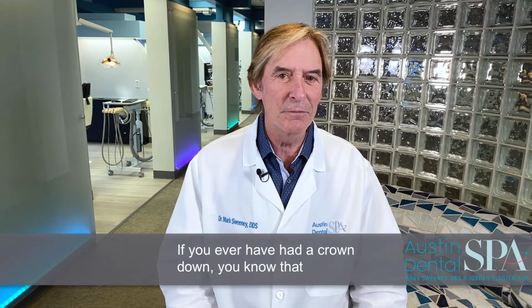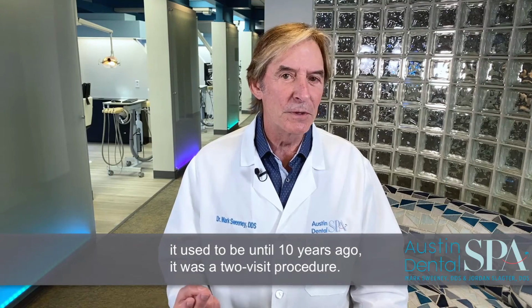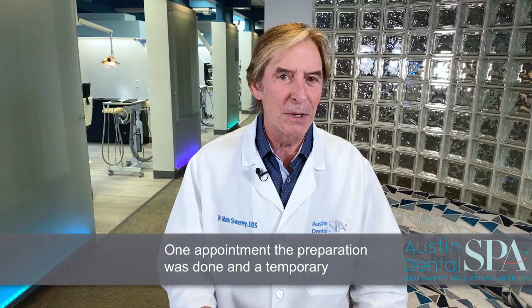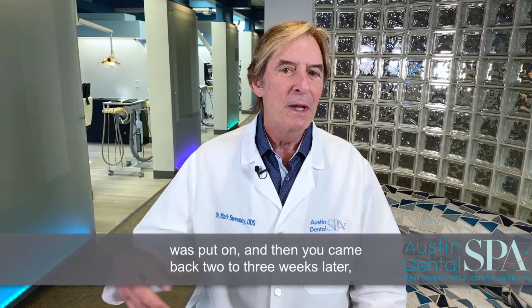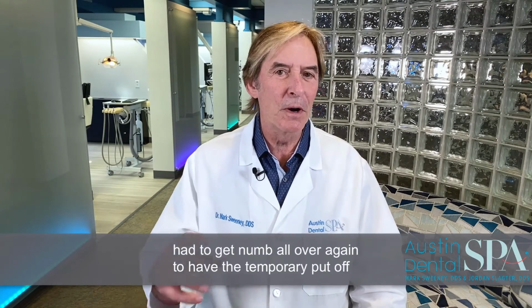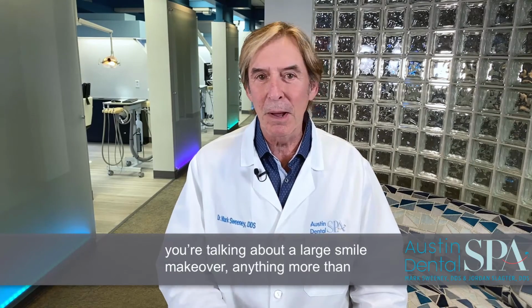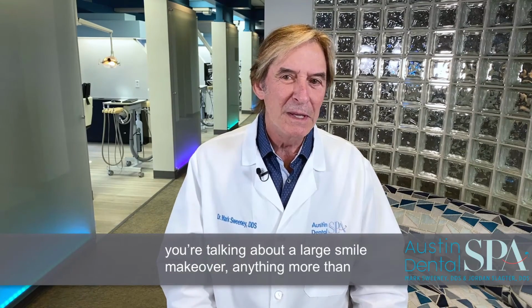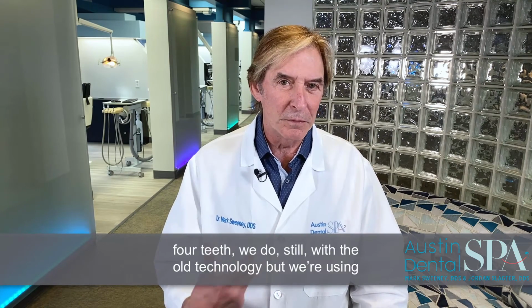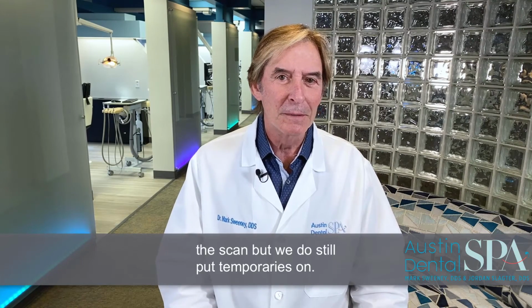If you have ever had a crown done, you know that until 10 years ago, it was a 2-visit procedure. You had to get numb 2 different times. One appointment, the preparation was done and a temporary was put on, and then you came back 2 to 3 weeks later, had to get numb all over again to have the temporary taken off and the permanent crown put on. That's kind of a thing of the past most of the time, unless you're talking about a large smile makeover, anything more than 4 teeth. We do still, with the old technology, but we're using the scans, we still do put temporaries on.